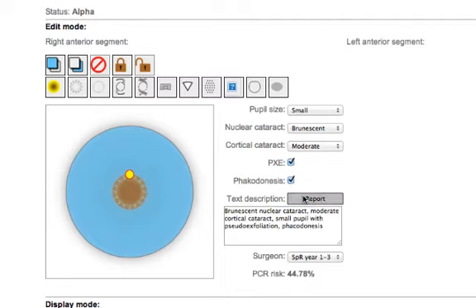Now if we click the report button you can see that the risk is now 44% and that may well tip the patient against surgery as opposed to telling them 2% which although is correct for an average is not true for them.